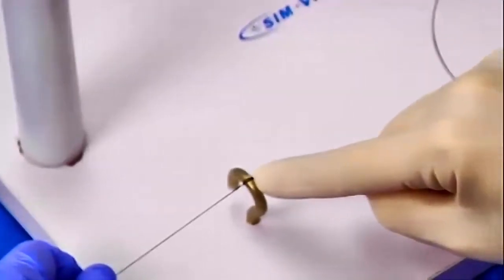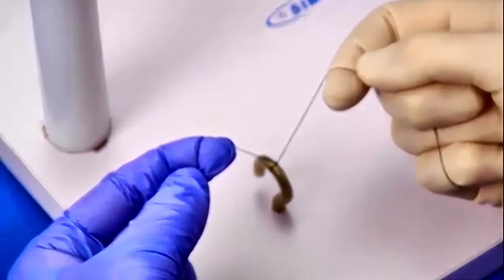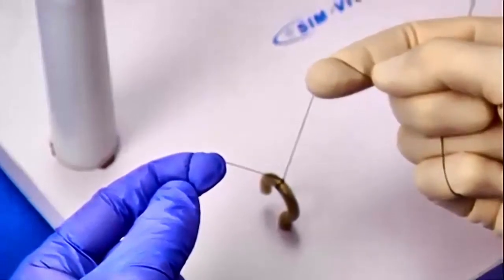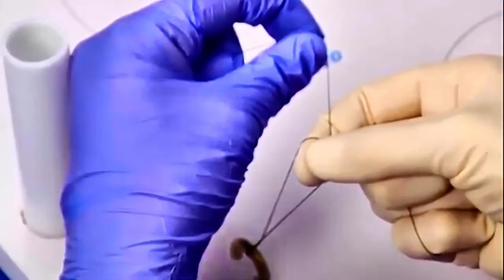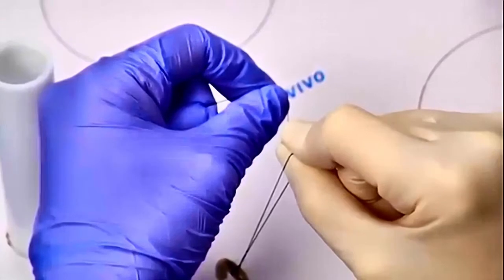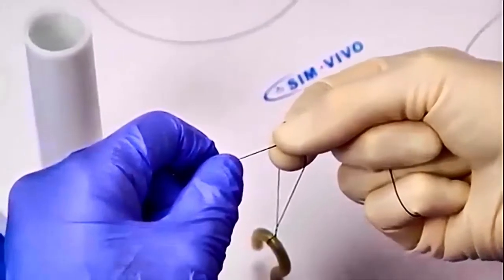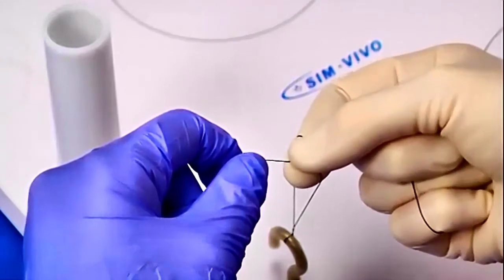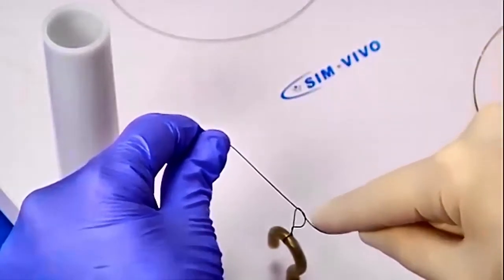Now for the second throw. After placing the first throw, we now hold the suture as if holding the reins of a horse. The index finger of the active hand extends over the strand and pushes it laterally. The passive hand loops the free end around the index finger post. The thumb then opposes to the index finger and pushes through the loop. The free end is then placed between the index finger and thumb. The index finger then pushes back through the loop and the end of the suture is retrieved by the passive hand. In order to bring this throw down flat, the hands have to be crossed slightly as the throw comes down. The index finger of the active hand is still used to cinch the knot securely to the hook.